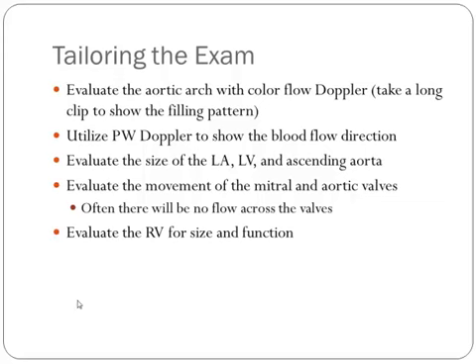So when you're trying to tailor your exam specifically to hypoplastic left heart syndrome, you're going to want to evaluate the aortic arch with color Doppler. And this is a situation, don't be afraid to take a long clip to show the filling pattern. If your echo parameters are set for 2 beats, this is a great time to switch it over to time and give yourself 10 or 20-second loops and just let the aortic arch fill through several cardiac cycles. Don't worry, we won't yell at you for taking a long clip.